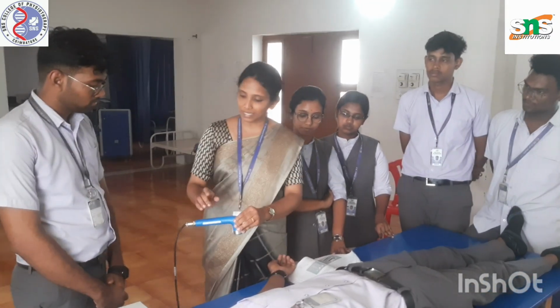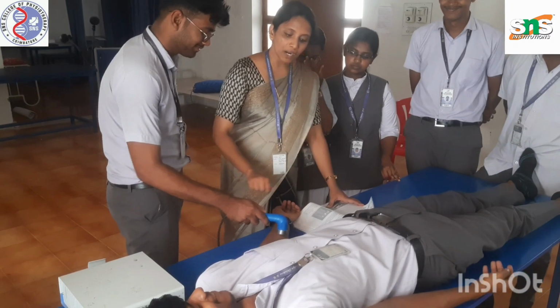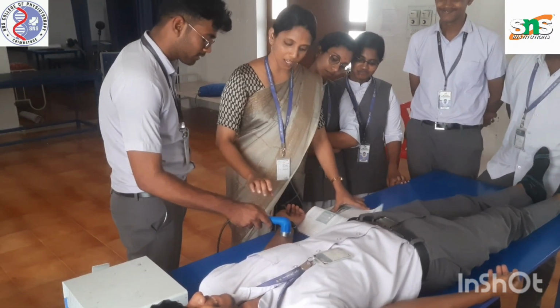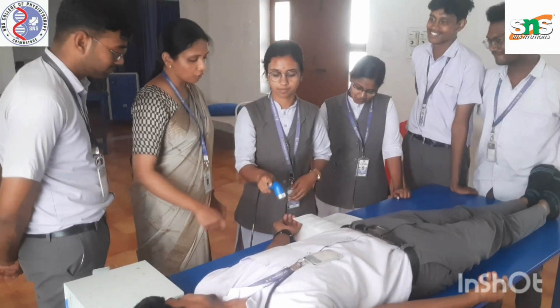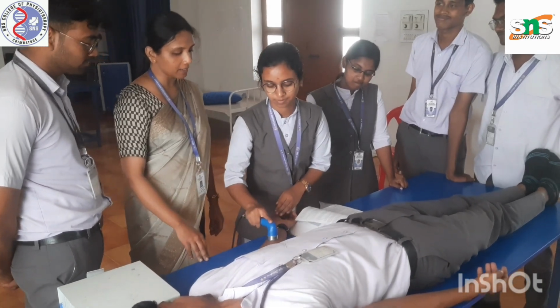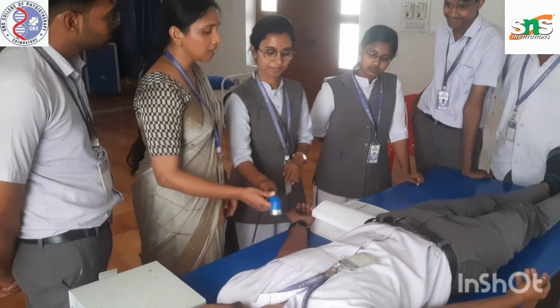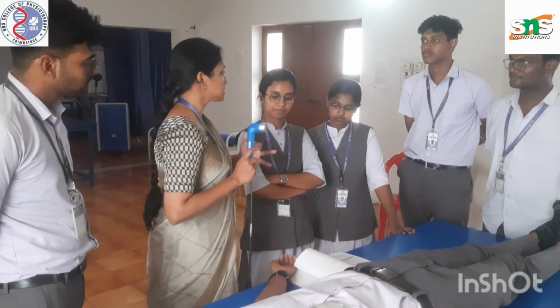Can you please try the concentric circle technique? Yes, but in a slow way, in a smooth way. Okay, yes, that's it. Can you please try the figure of 8 pattern? Yes, slowly, the figure of 8 pattern can be done. These things can be done with both the continuous mode as well as the pulsed mode.